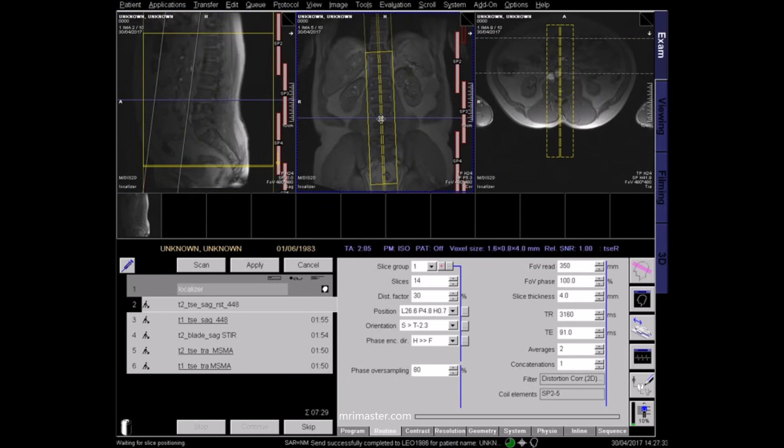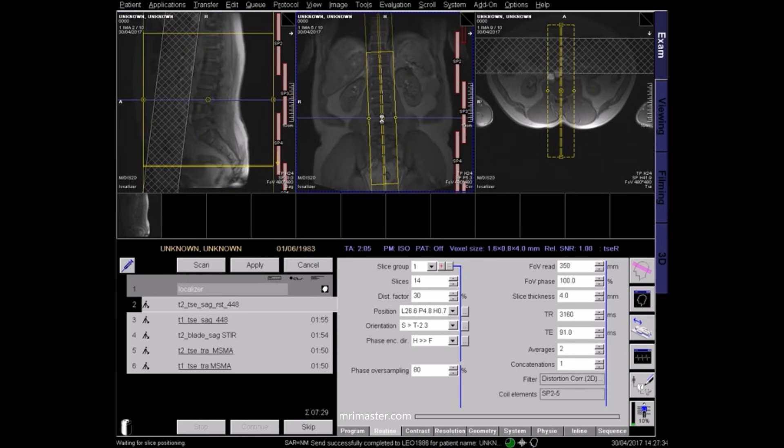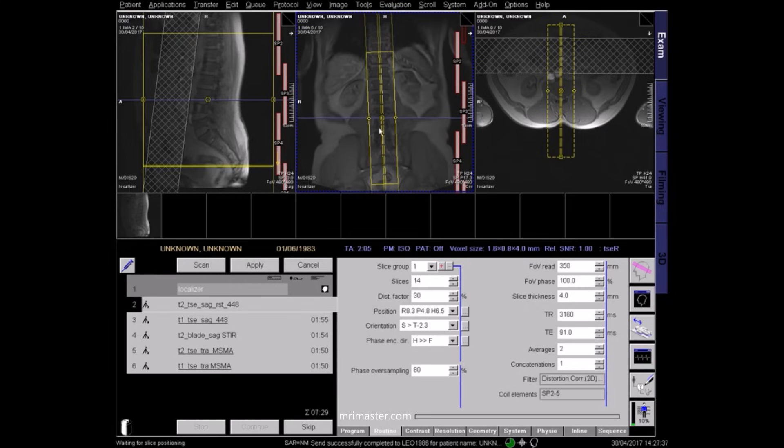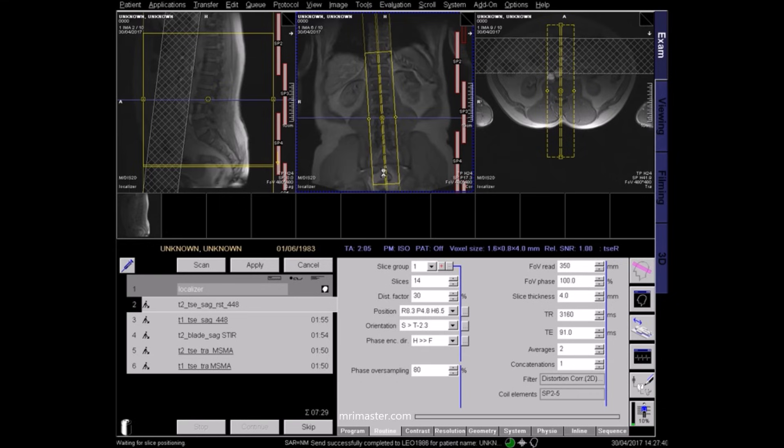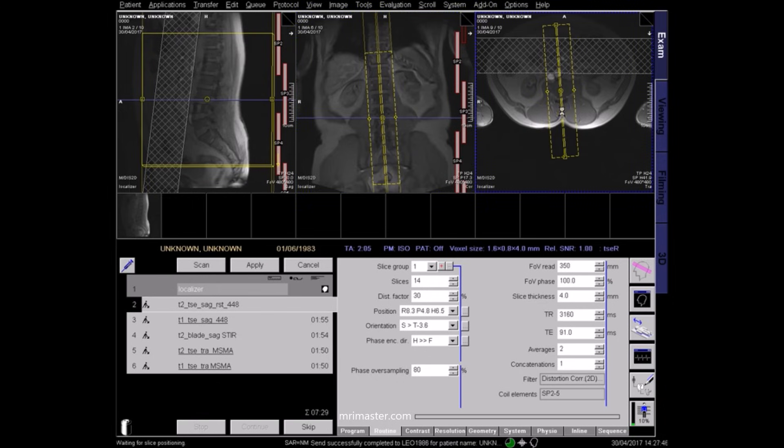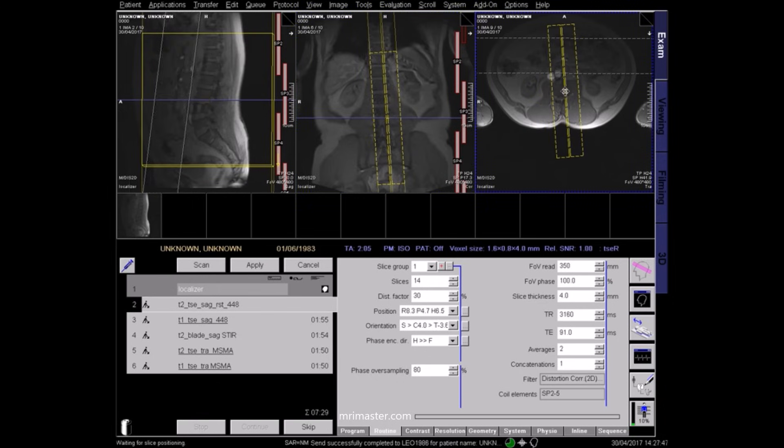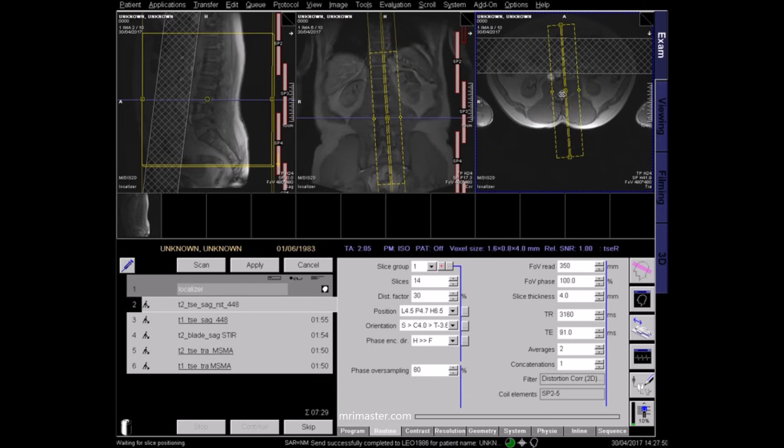On the coronal view, center to the midline of the vertebra, ensuring coverage of the transverse processes from side to side. On the axial view, again center to the midline and angle the slices parallel to the spinous process.